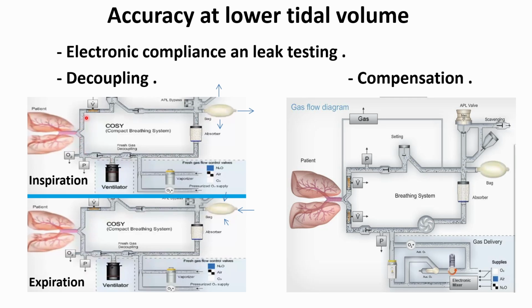At this time the circle goes as usual. During expiration this valve will open and allow renewing of the oxygen content and the inhalational gas inside this.